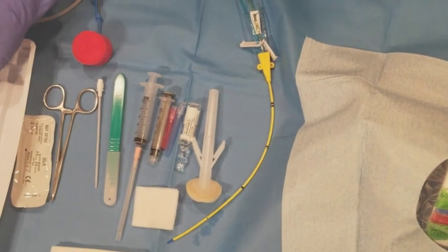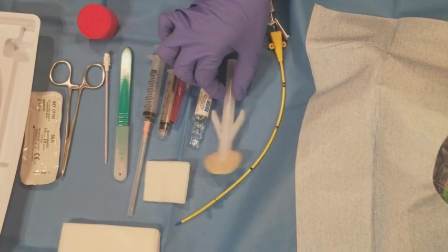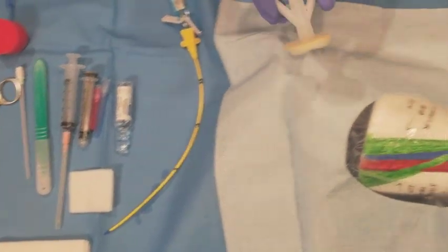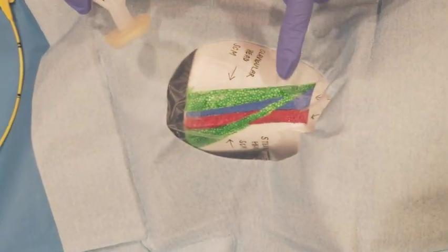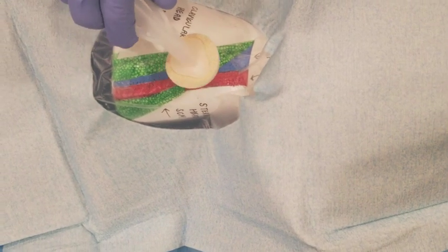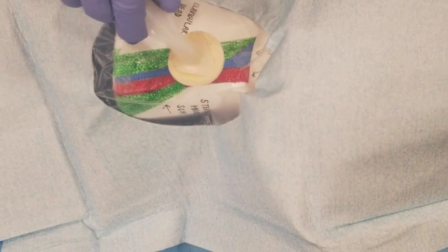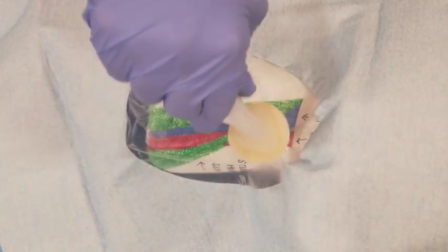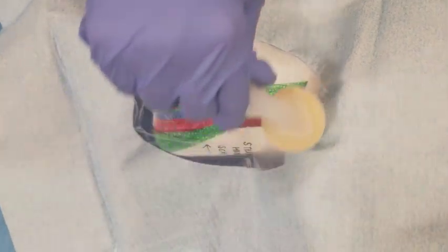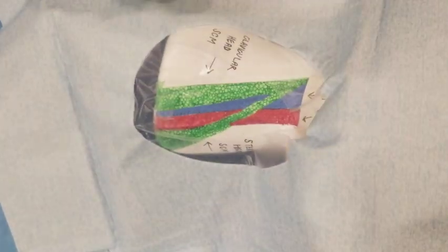After we ensure that the lines are patent, we want to prep the skin. This is our core prep. We want to push inside, and we're entering at the right internal jugular vein. So you want to press inwards and just clean in a circular format, just like this. Okay.